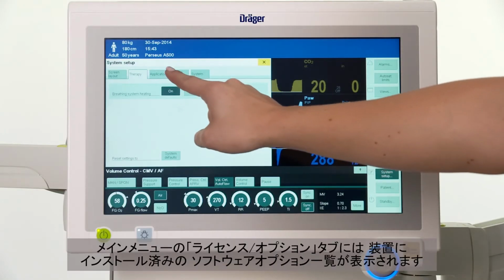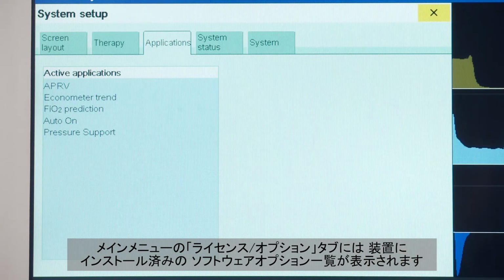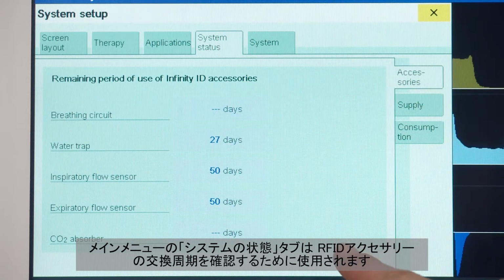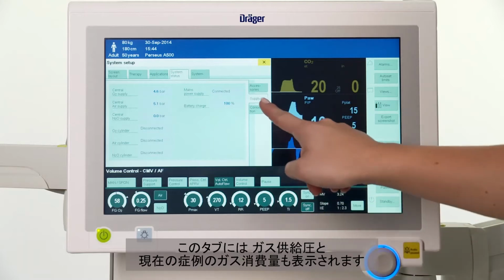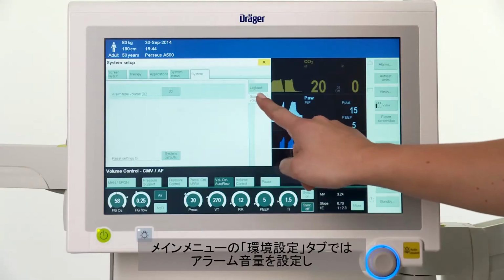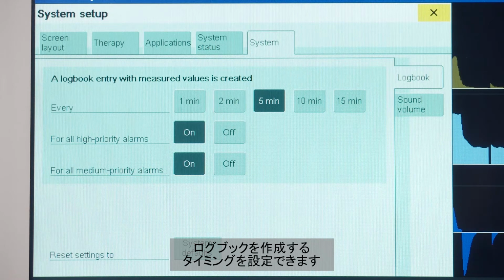The main menu tab, Applications, lists the software options installed on the device. The main menu tab, Systems Status, is used to check the replacement cycles of your RFID accessories. This tab also provides the supply pressures and the gas consumption of the current case. Use the main menu tab, System, to configure the volume of the alarms and to configure when you would like the system to generate log entries.